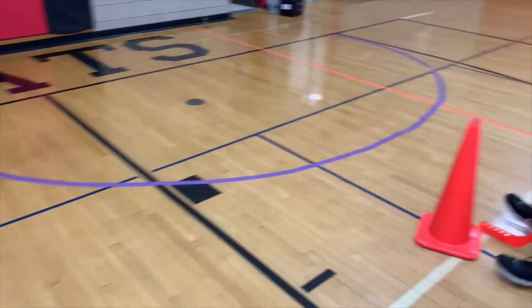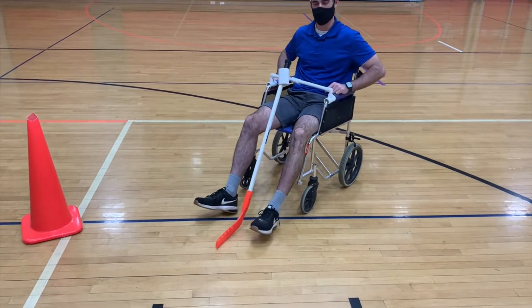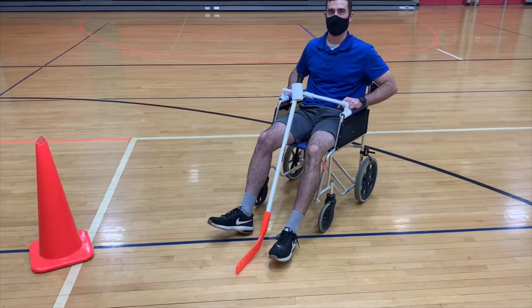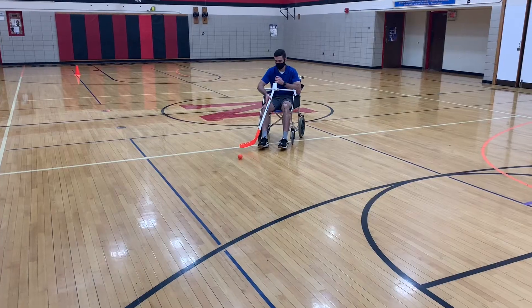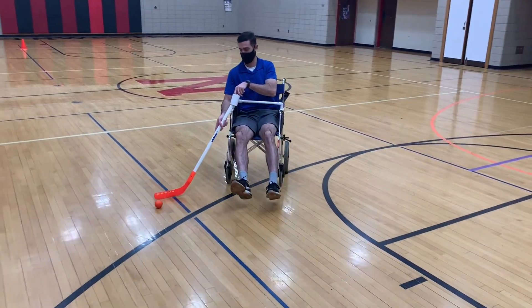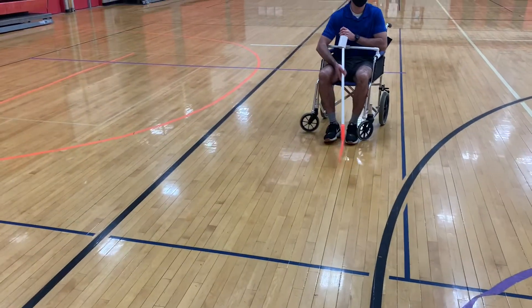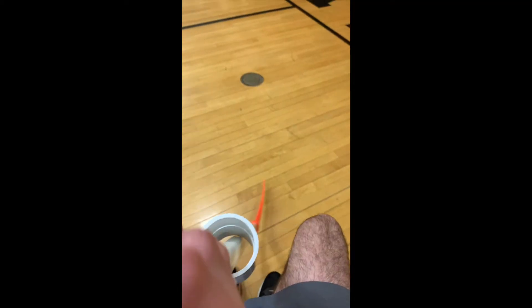Now, obviously he's using his feet, but in a normal situation a student would use their arms to move around. Or you could have a teacher aide pushing the student around throughout the course and throughout the gym. As you can see, the stick would glide if the student was pushing himself, or you could hold it and someone could push him.